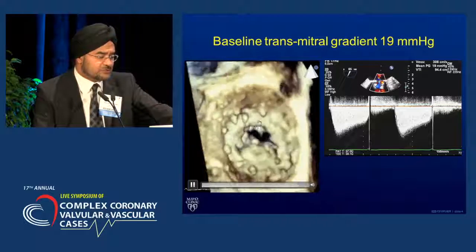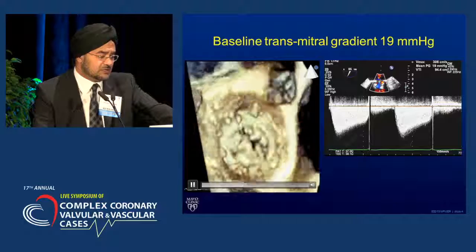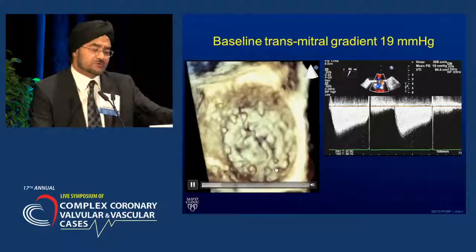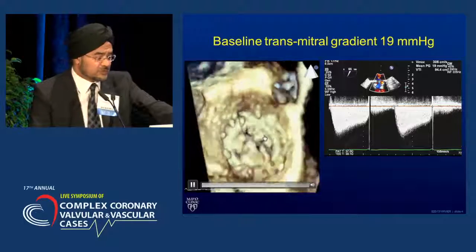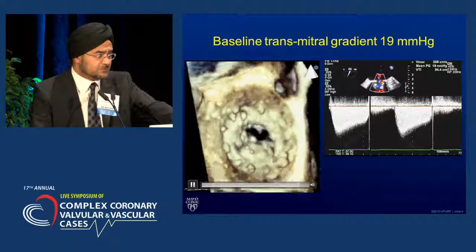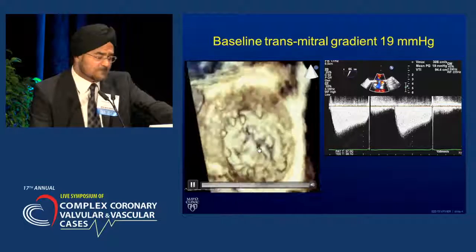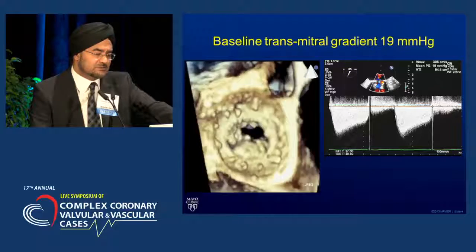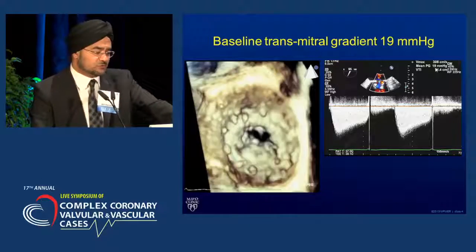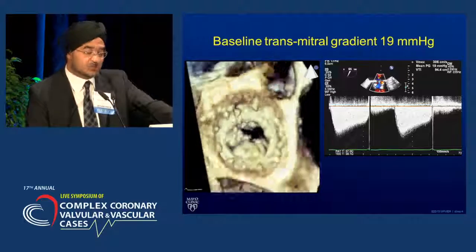On the three-dimensional transesophageal imaging, here's the bioprosthetic sewing ring — this is the left atrial view, which emulates the surgical view intraoperatively. One can appreciate that the prosthetic leaflets are thickened and mostly immobile with a very small bioprosthetic opening. The gradient is high — almost 20 millimeters at rest. So there's a variety of options that can be thought about.